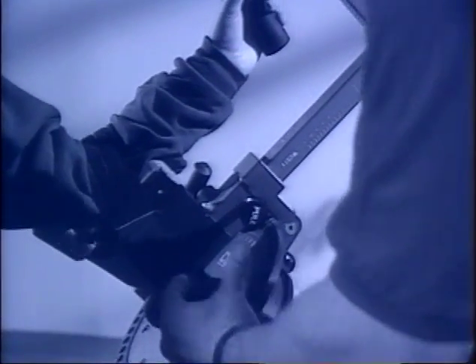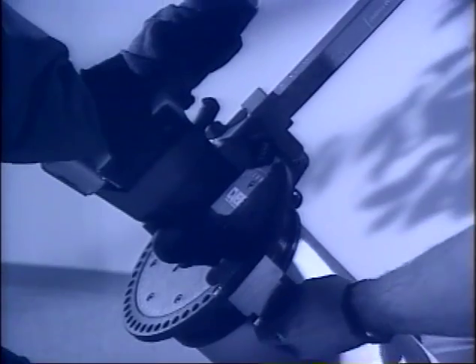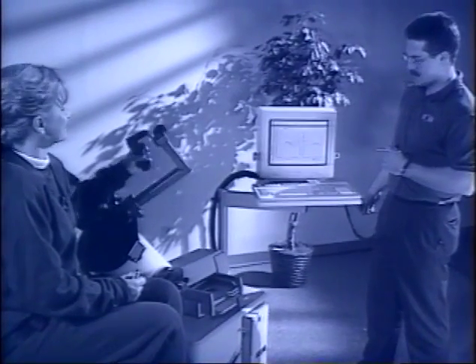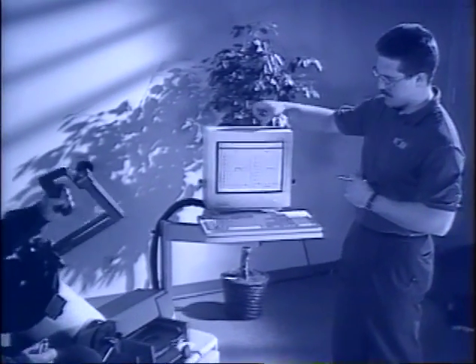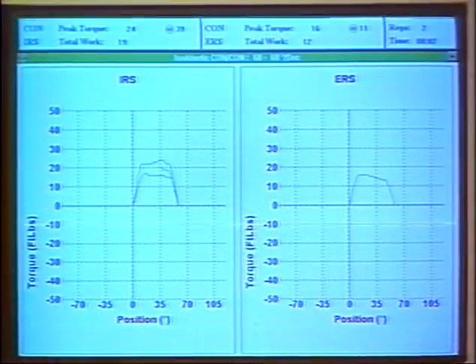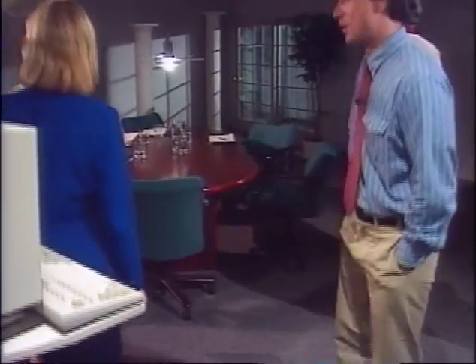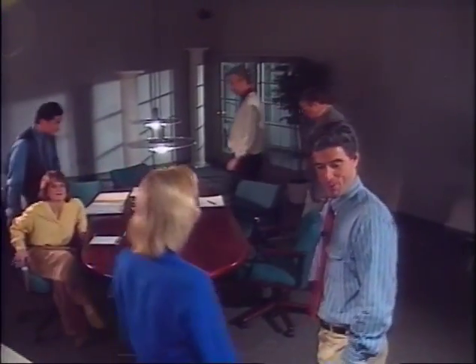Patient positioning, data retrieval, and adapter placement make all of NORM's 9 shoulder patterns extremely efficient and comfortable for the patient. Based on independent research, the NORM system effectively rehabs the patients in less time using isokinetics than any other form of exercise. I can vouch for that. I've used CYBEX isokinetic equipment for years. Then the NORM system will be a welcomed addition to your facility. Well, folks, why doesn't everybody take your seat, and perhaps we can answer any further questions you might have about our new friend, NORM.